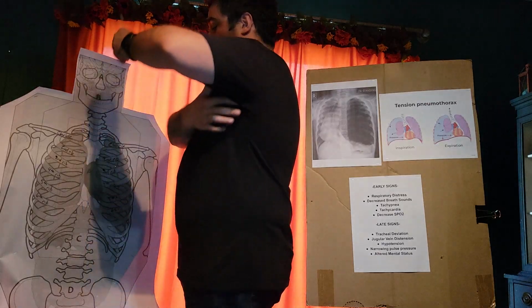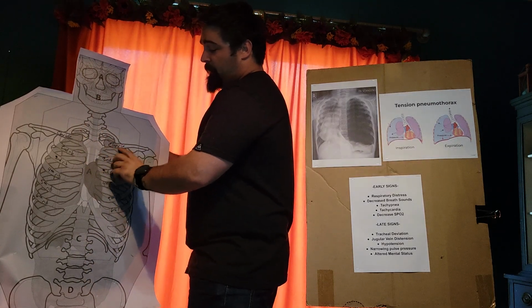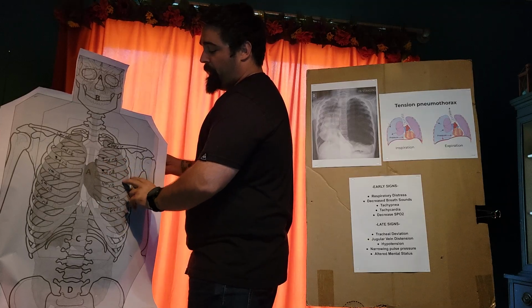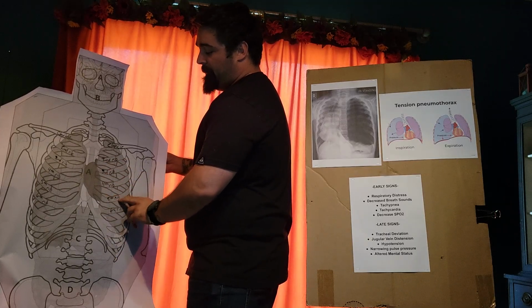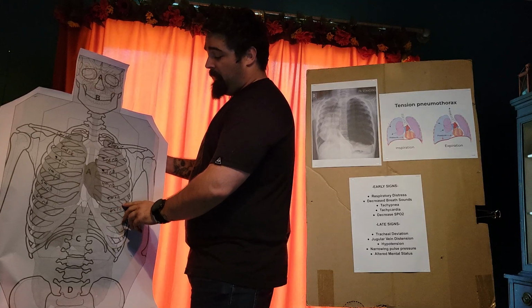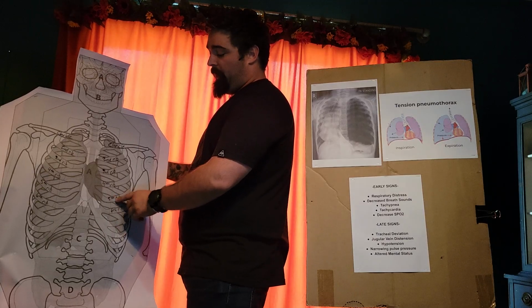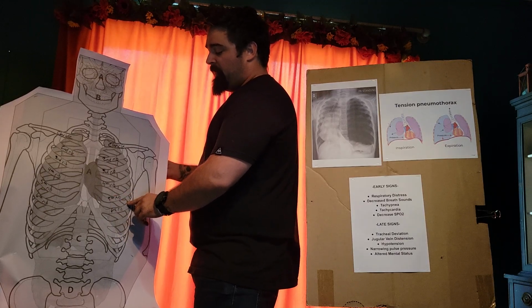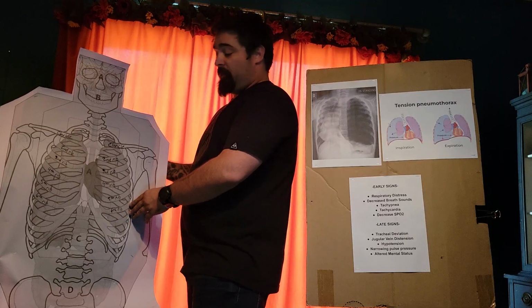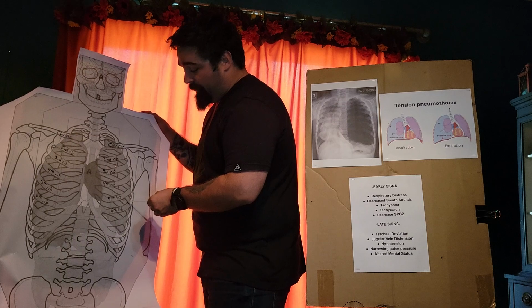So you have palpated down: clavicle, 2nd, 3rd, 4th, 5th rib, 6th rib. In this case, we're going 6th rib into the 5th intercostal space. Again, we're going over the top of the rib. We're not going underneath the rib above. And again, it's a 90-degree angle to the patient. So you're sticking here, and you're going to have all the same indicators.